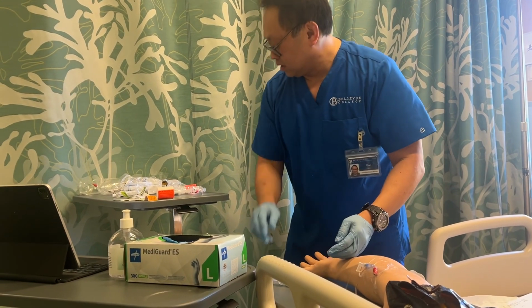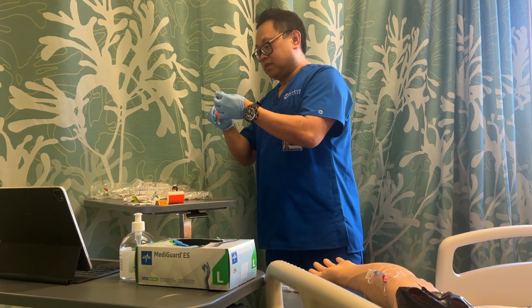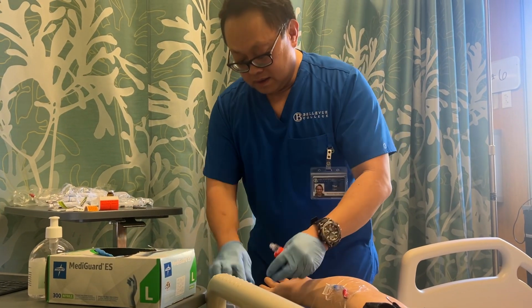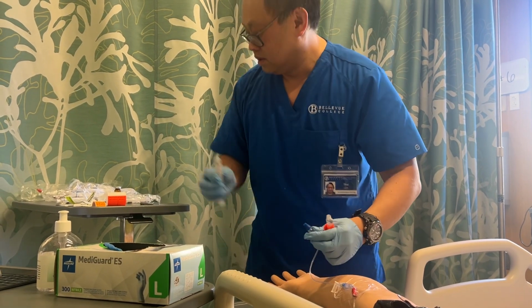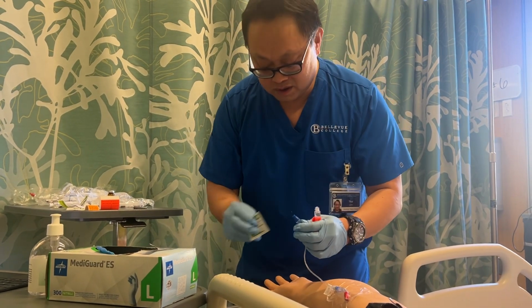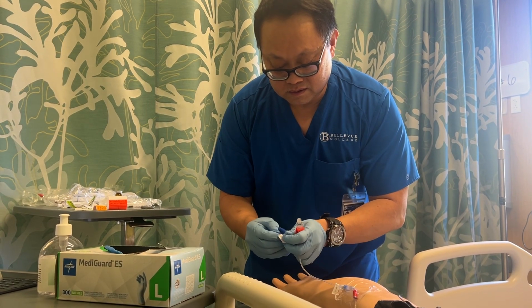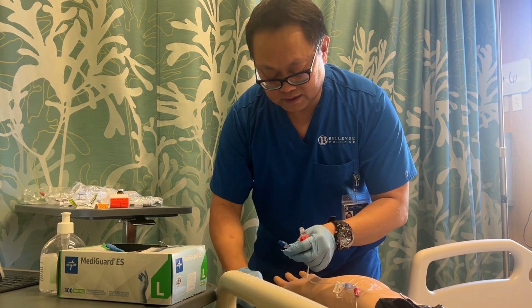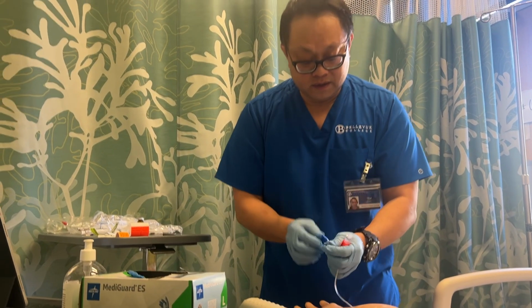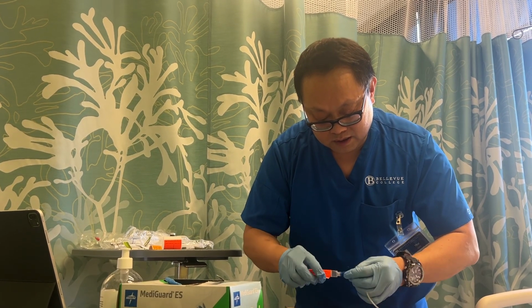Okay, so now I'm going to get my medication ready, and then I would uncap this. Okay, and I'm going to put this here. Again, just to make sure, I'm going to scrub the hub again for 15 seconds, let it dry for 5. Depending on the facility, each facility is different. And I'm going to connect the medication.